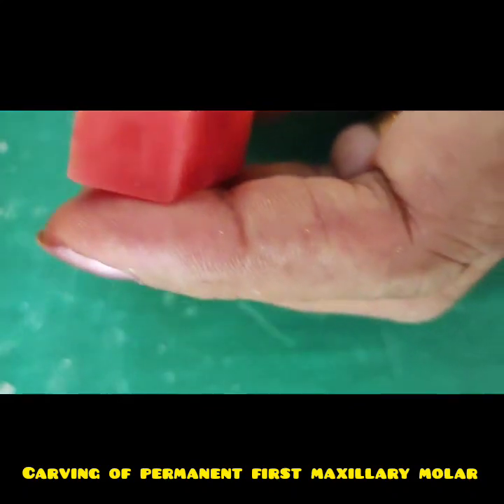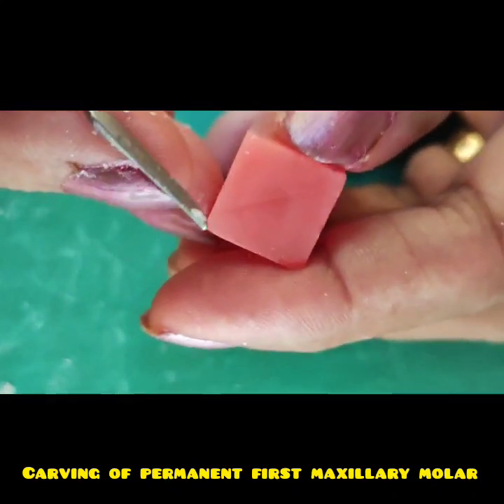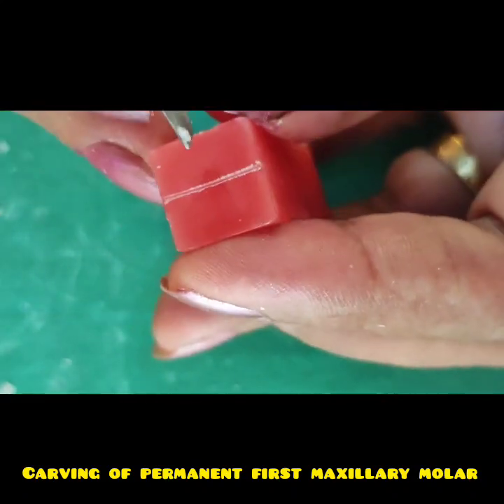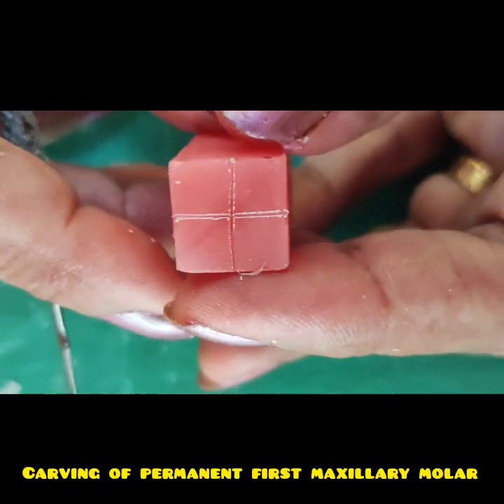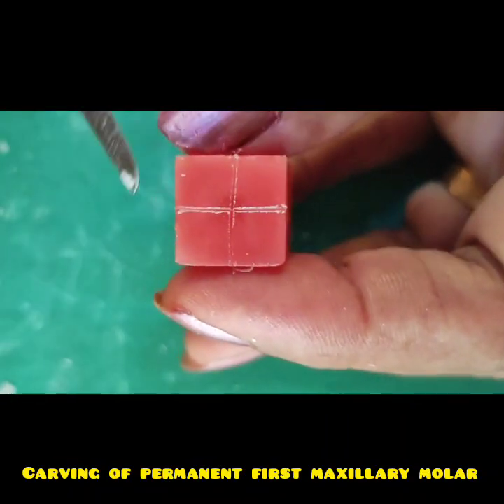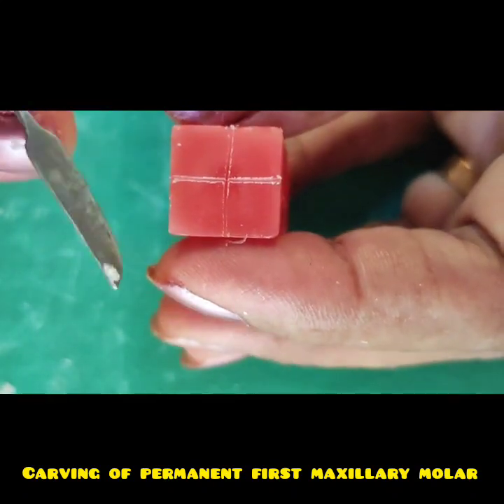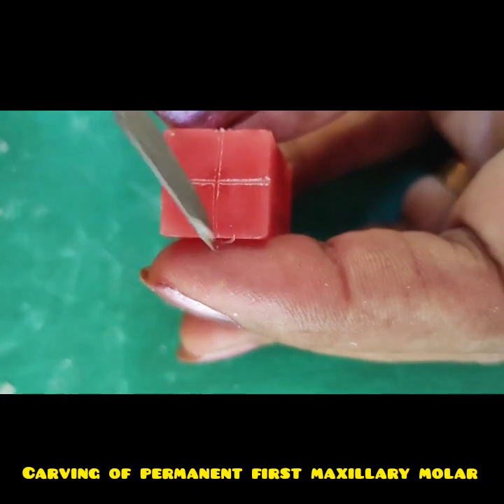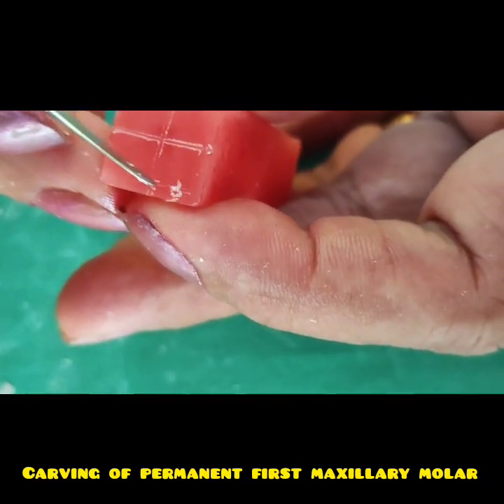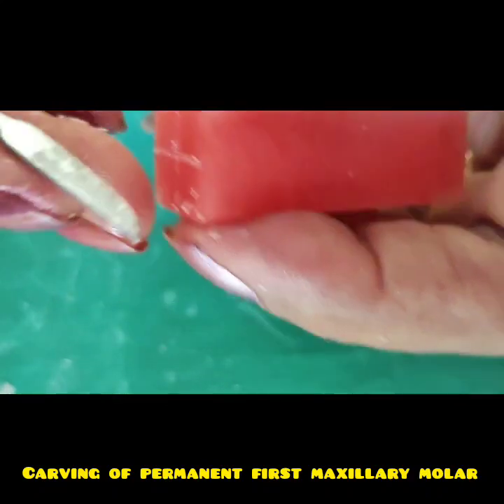Now let us see the occlusal, the crown, how to carve a crown of maxillary first molar. What I do is, I always divide the block on the top, and the occlusal outline of maxillary first permanent molar is not square, it is kite shape. So the opposite diagonal angles, I'll reduce 1 mm of wax at the corners, so that these 2 angles will become obtuse.